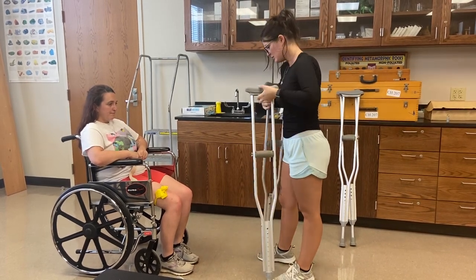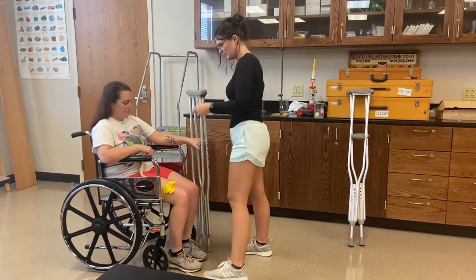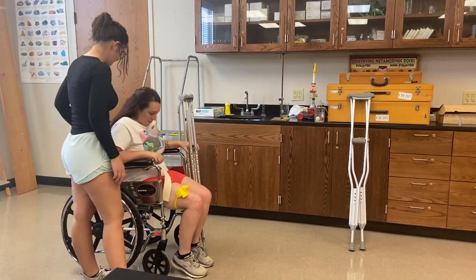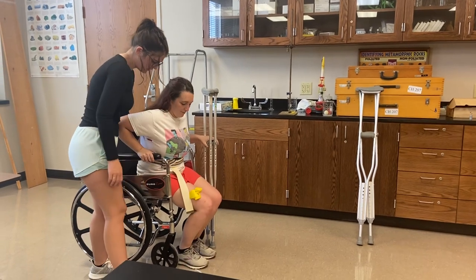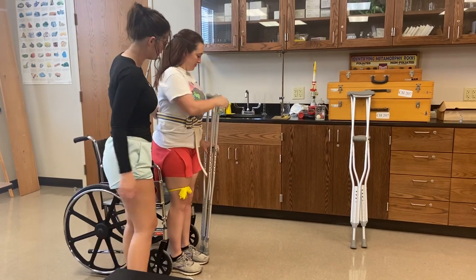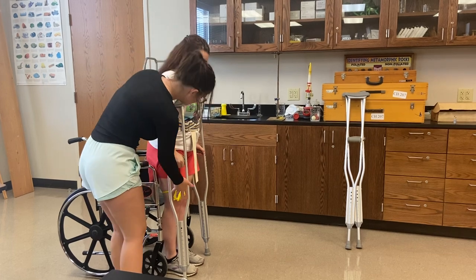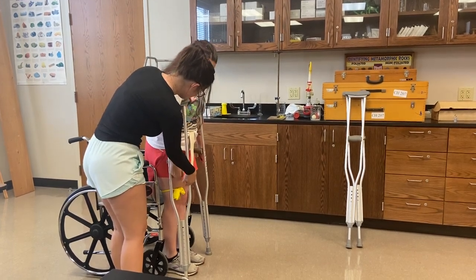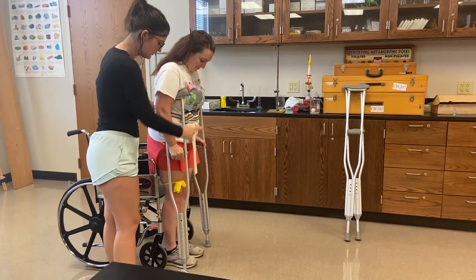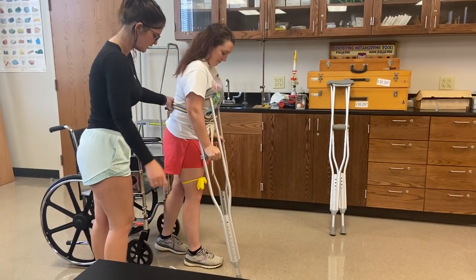Now I'll give these back to you — grab right here. I'll have you push into the back of the seat and push forward. Hand right there, and we'll stand up on the count of three — one, two, three. I'll have you grab that one and dangle your hand down. Now we'll start walking with good crutch and then bad leg, and now opposite crutch, good leg.